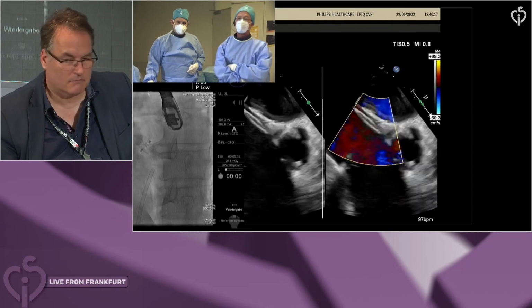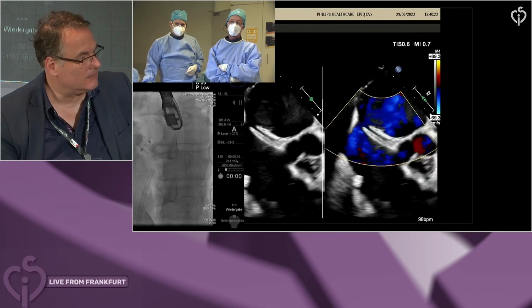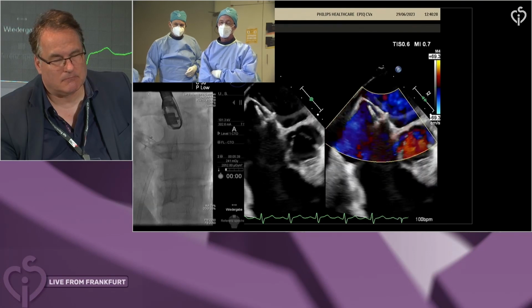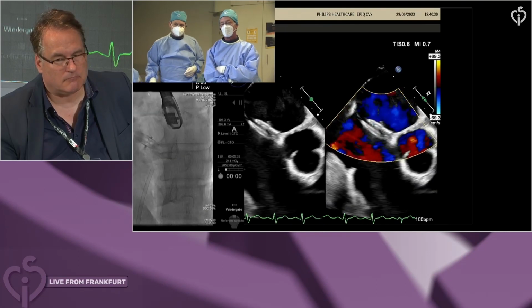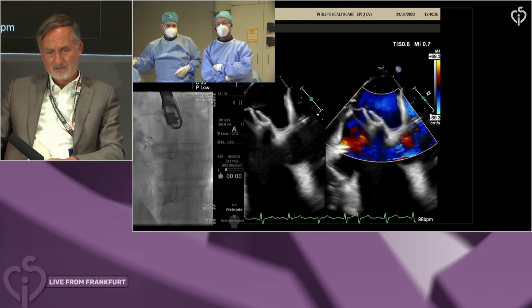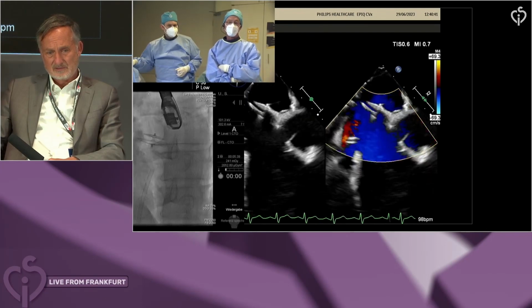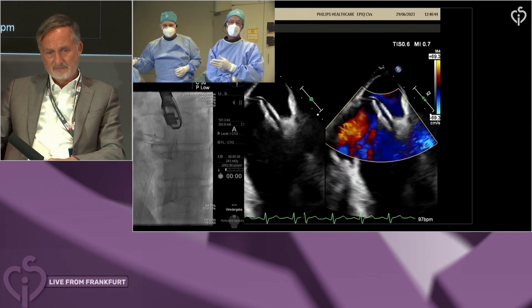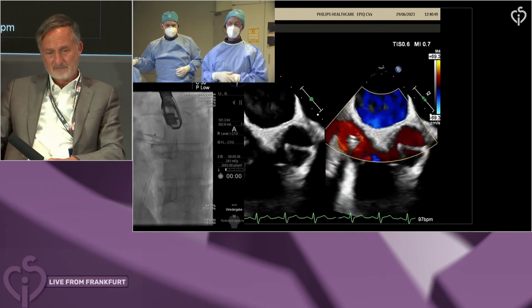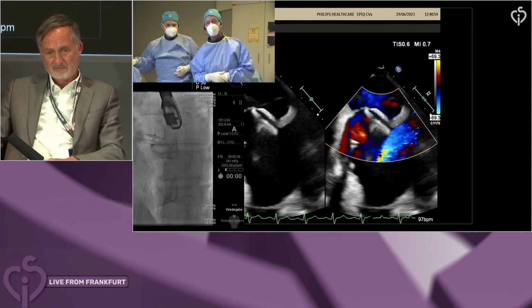Oh, PFO erosions, we have seen one 20 years ago, 25 years ago, and there are, I think, 2 other reports in the literature. So erosion with PFO devices is really extremely rare. By the way, the patient with the erosion we had was a 25 millimeter Amplatzer PFO, and everything regarding the anatomy was normal. The left atrium was a little bit smaller than average, but not a significant difference. The septum was a little bit shorter than average, but still within range. So nothing was special there.